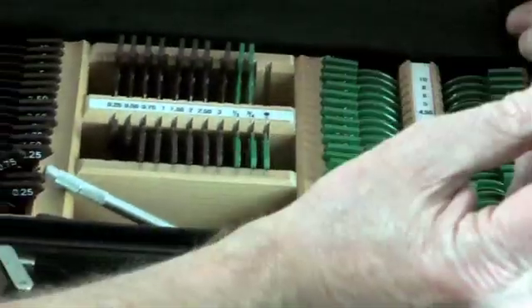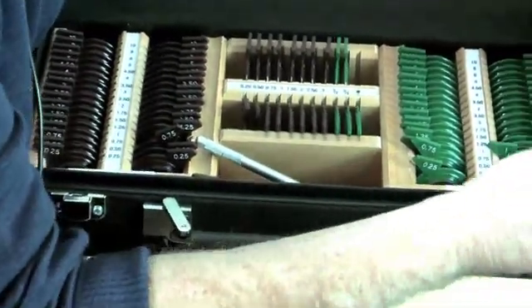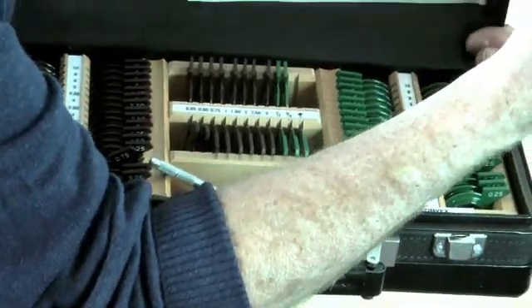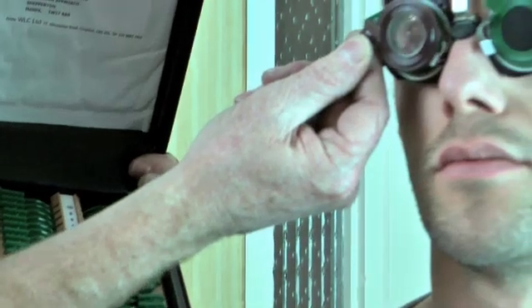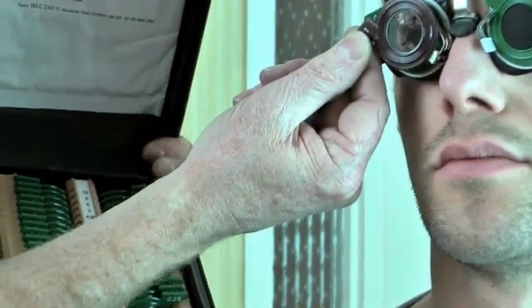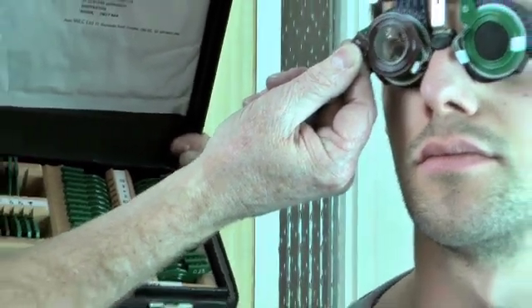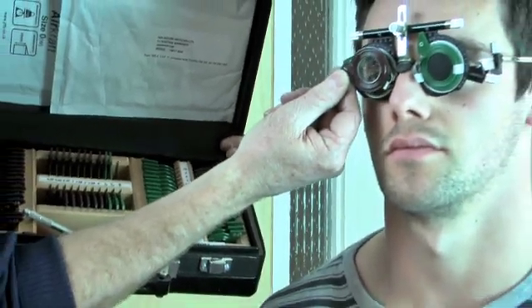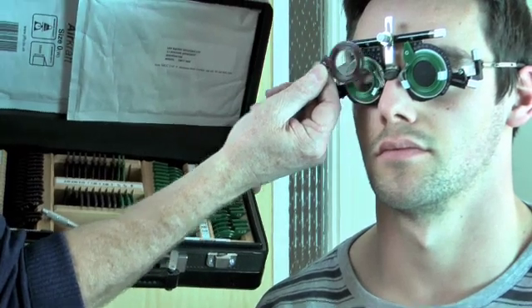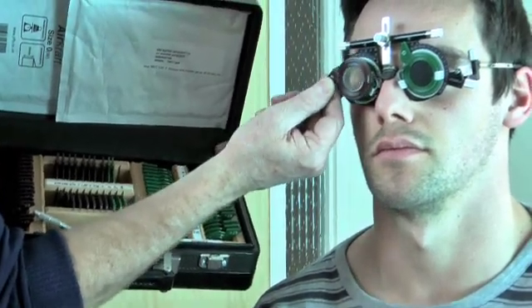So we could then maybe offer up a minus 1. This is a minus 1 lens. We put that over the eye and say, is that better or is that worse? And if they say it's looking better, then you say, okay, well, let's put a slightly stronger lens into the trial frame.